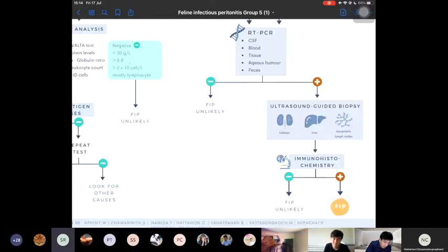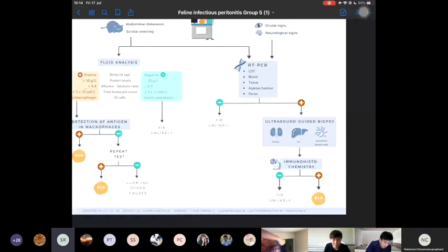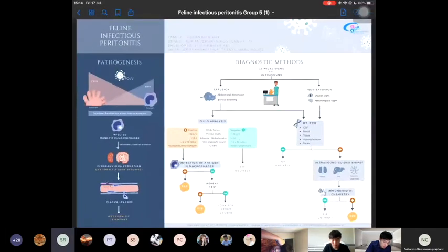The result of RT-PCR for coronavirus RNA can be reported rapidly, and is usually quicker than immunostaining on any samples. But immunostaining can provide a definitive diagnosis, whereas RT-PCR does not.